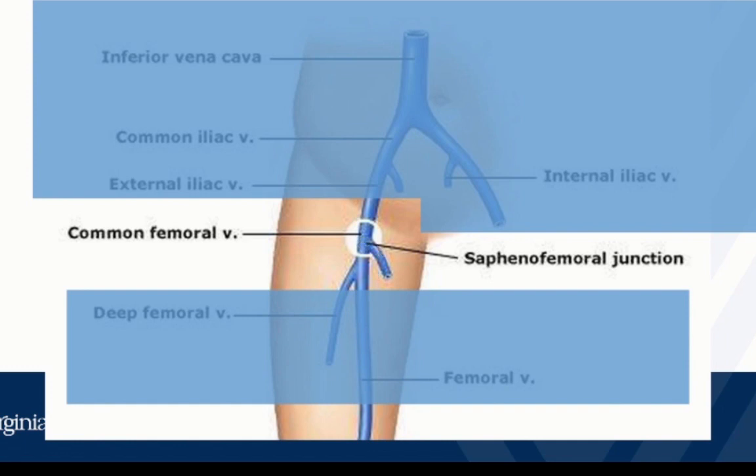One other tip: get the patient as flat as they can tolerate. If the patient is sitting straight upright with their waist at a 90-degree angle, that's going to make your exam harder and also increases the pressure in the veins, making them harder to compress — which may lead to false positive studies. So get the patient as flat as possible. So that's our first junction: get the probe in their groin, identify the femoral artery, the vein next to it, and slide up and down until we see the sapheno-femoral junction.